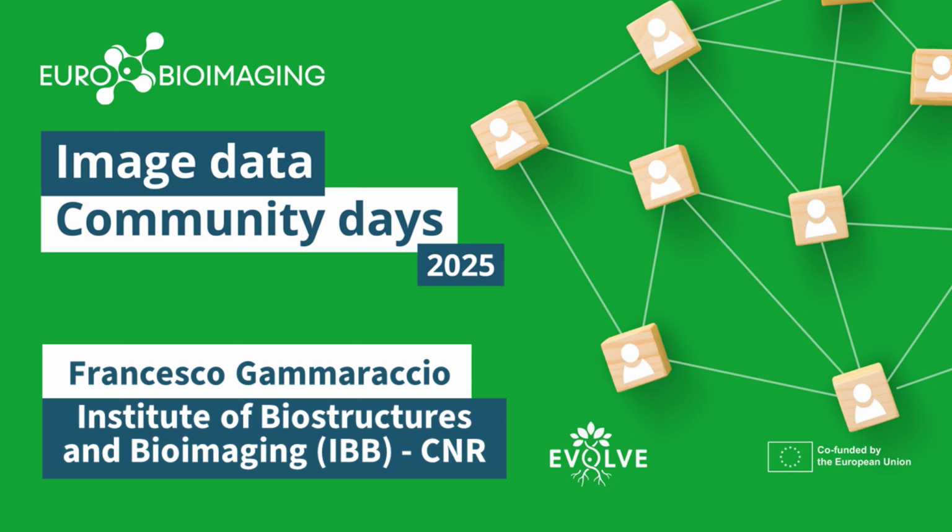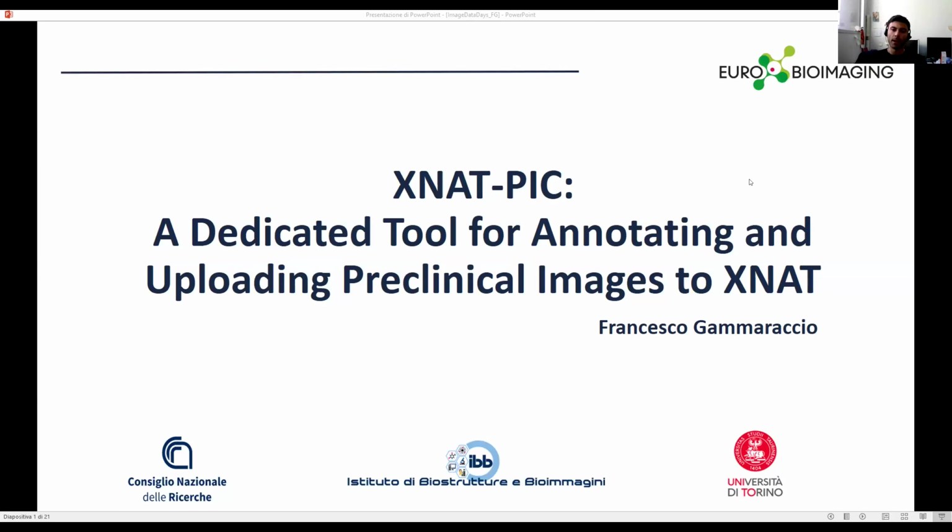Present XNAT-PIC, a desktop application for annotating and uploading preclinical images to XNAT.